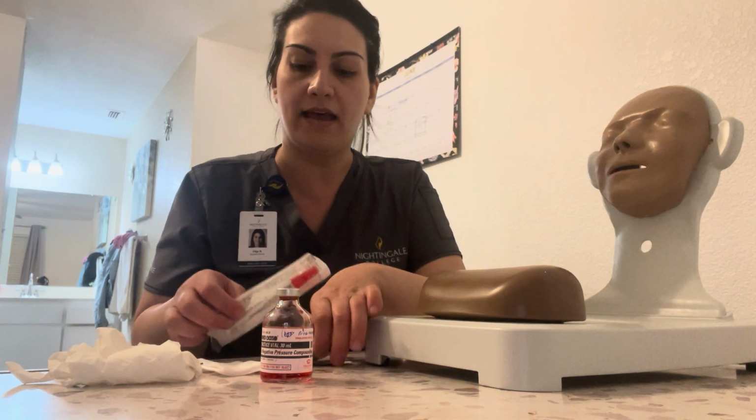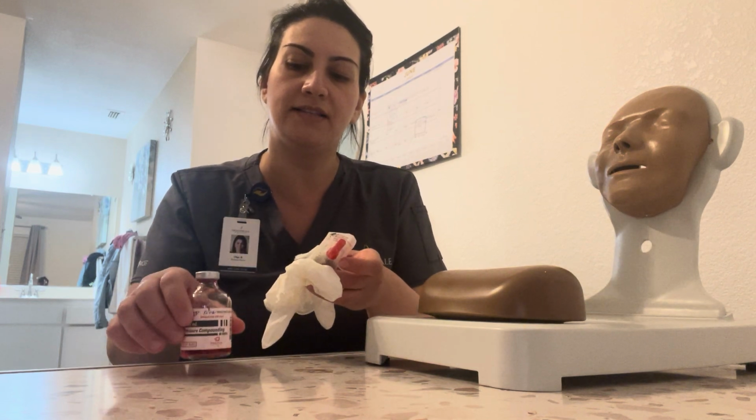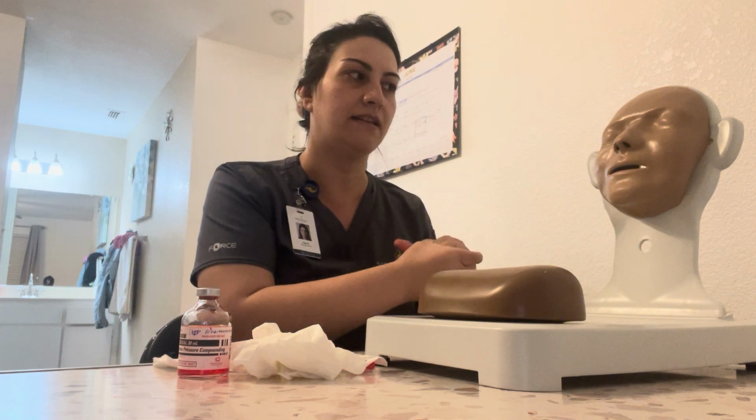Next, we want to go ahead and gather our supplies here. I want to knock, enter, close the door behind me to avoid any HIPAA violations. I'm going to set my supplies here on a clean, dry surface. And I'm going to go ahead here, hand hygiene, and introduce myself to the patient.